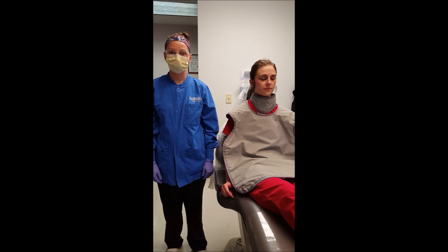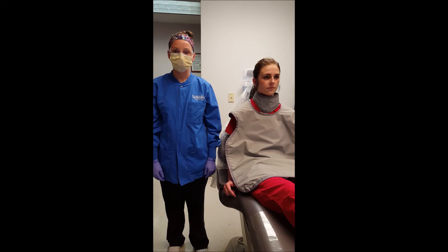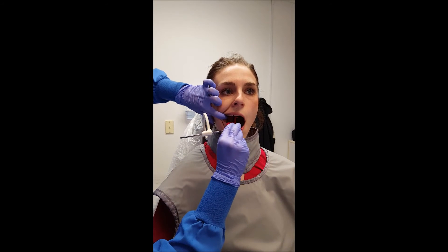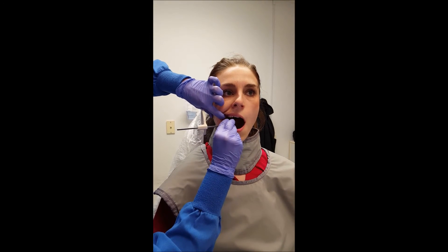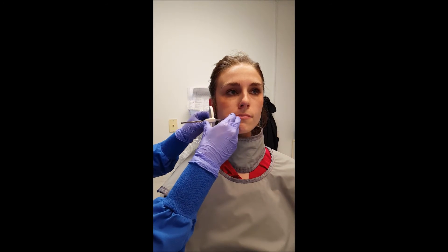The patient will be sitting upright with the maxilla parallel to the floor. The patient chair should be approximately at the waist level of the operator. When placing the instrument and phosphor plate in the patient's mouth, the x-ray film holder will need to be aligned between the first and second maxillary molars, as well as the distal half of the most distal molar visible for the molar projection.